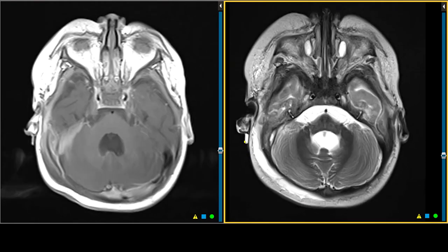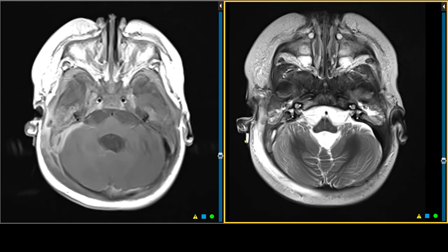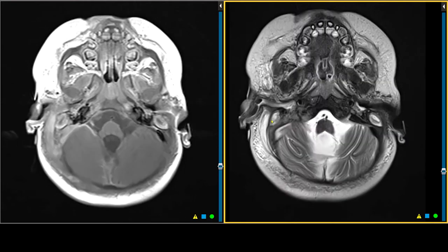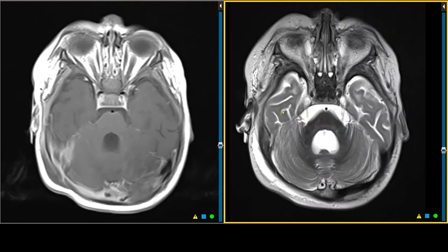Here in the mastoid region, we see bilateral opacification on T2-weighted scan of the mastoid air cells. On the right side, you also see the external auditory canal, which is opacified.